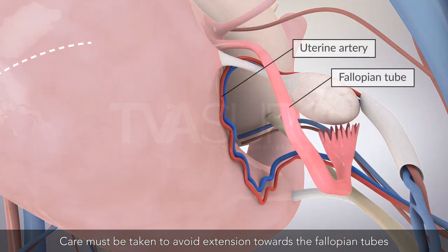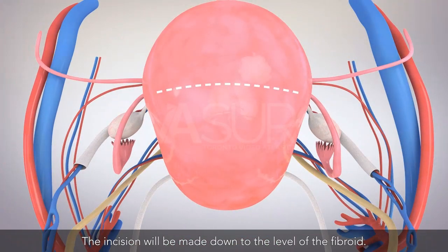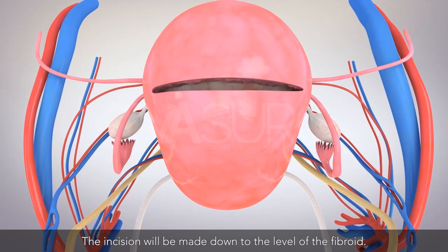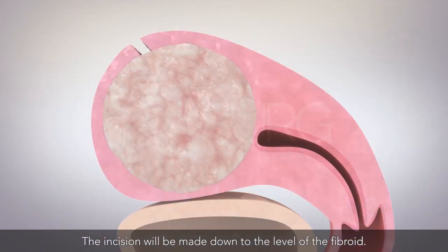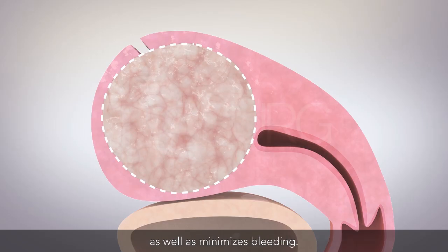Care must be taken to avoid extension towards the fallopian tubes or the uterine arteries. The incision will be made down to the level of the fibroid. Proper identification of the fibroid plane facilitates enucleation as well as minimizes bleeding.